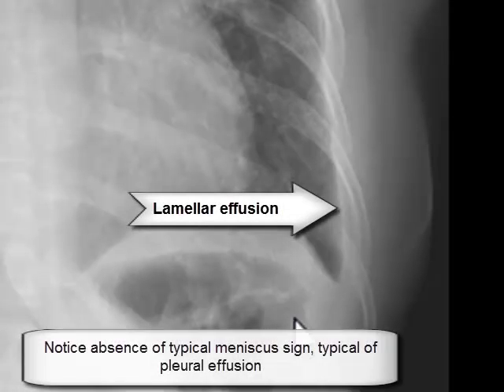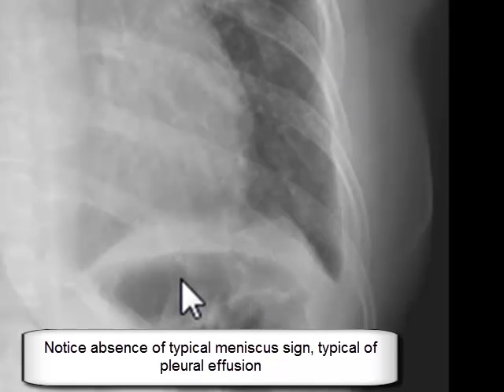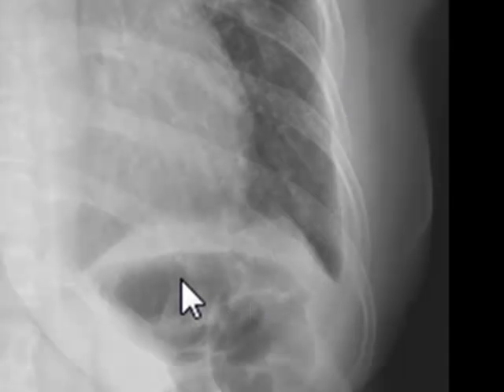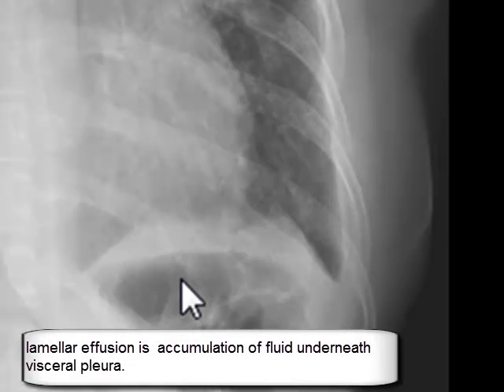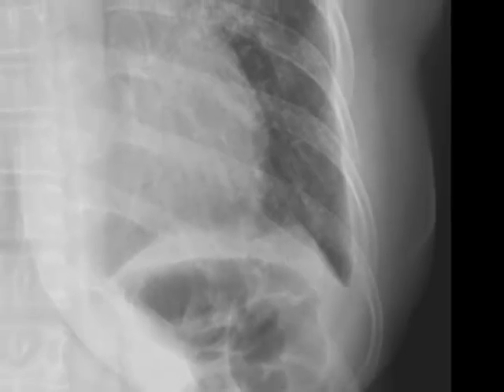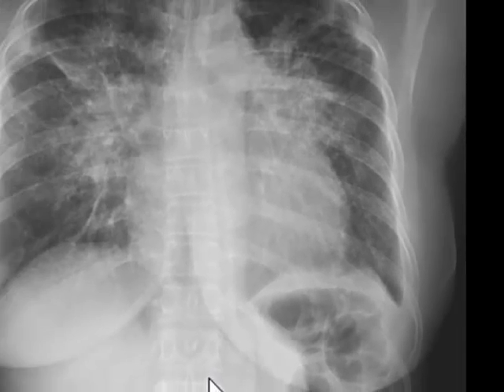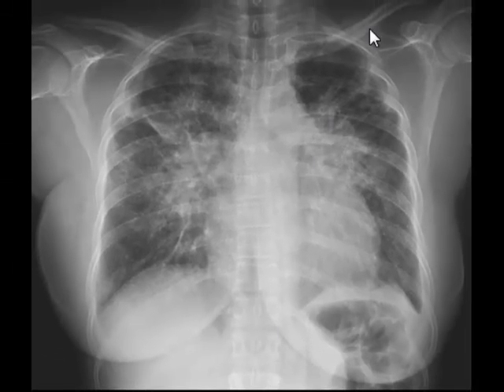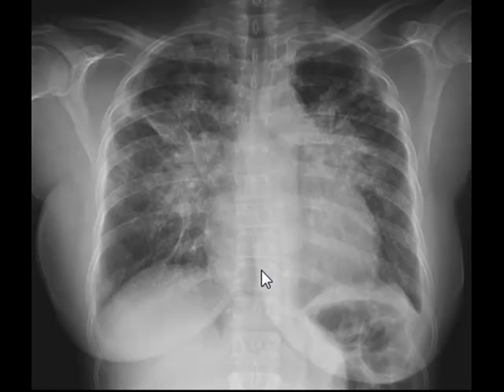If you look at the left costophrenic angle here, there is a soft tissue density between the chest wall and lung parenchyma, running almost parallel to the chest wall. This is known as lamellar effusion. It is caused by accumulation of fluid under the visceral pleura and is not a true pleural effusion — notice the absence of the typical meniscus sign. Lamellar effusion is typically found in cardiac failure.